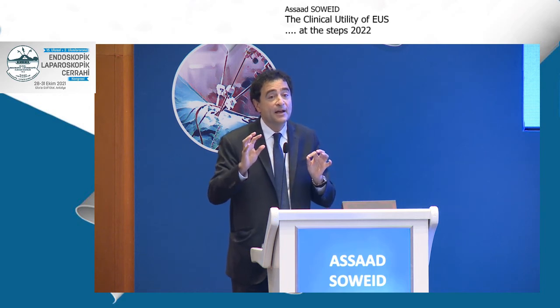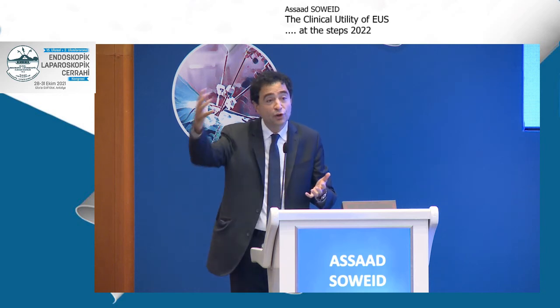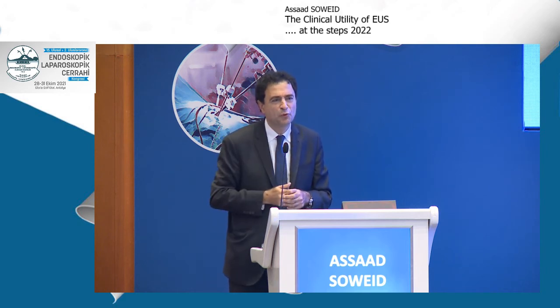So it's not permanent. It can be pulled out, but it depends on the size, on the presence of debris, and what you have done endoscopically. If you cleaned it all and it's beginning to collapse, yes, it can be removed. It doesn't have to go to zero. A few small centimeters, 3 to 4 centimeters, are fine.